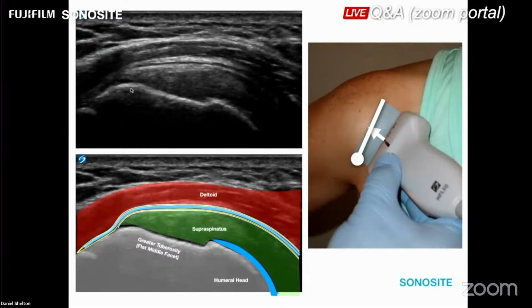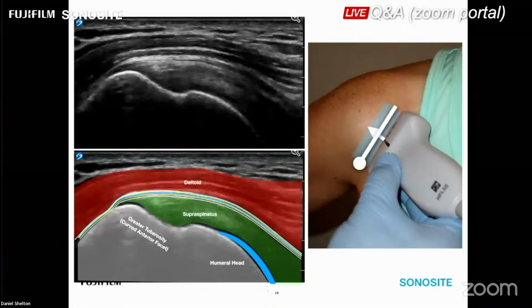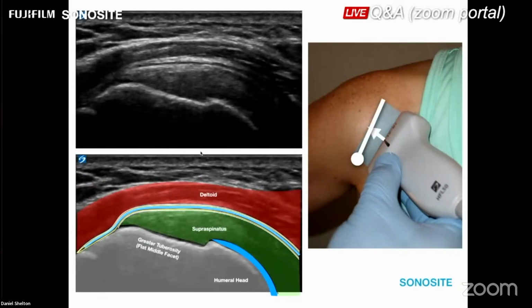If it flattens out like this, just be aware most of these fibers are actually infraspinatus coming in from the posterior margin, and be aware of any contour changes of the greater tuberosity. There's a big difference in going from here to here and how that is shaped, because as we see this greater tuberosity flatten out, it means you've gone so far posterior you're leaving the fibers of the predominant supraspinatus. Right in here, which should be illustrated but it's not, you start to see this overlapping wedge of anisotropic artifacts. Don't confuse that for a tear or pathology. That's infraspinatus.